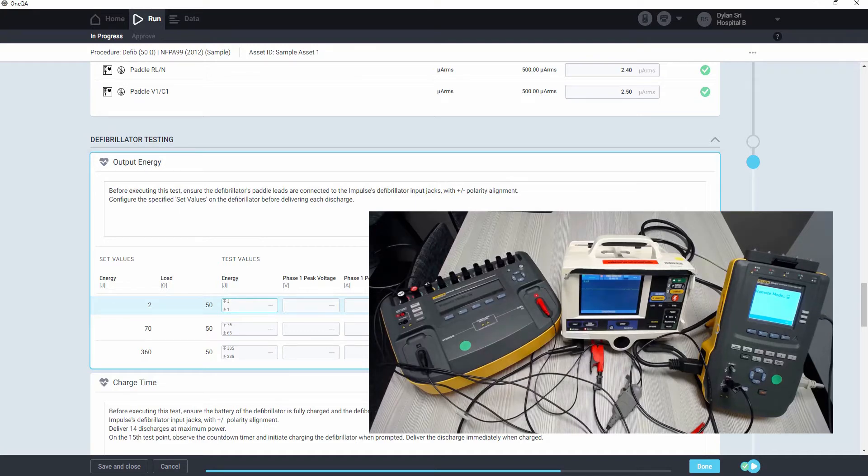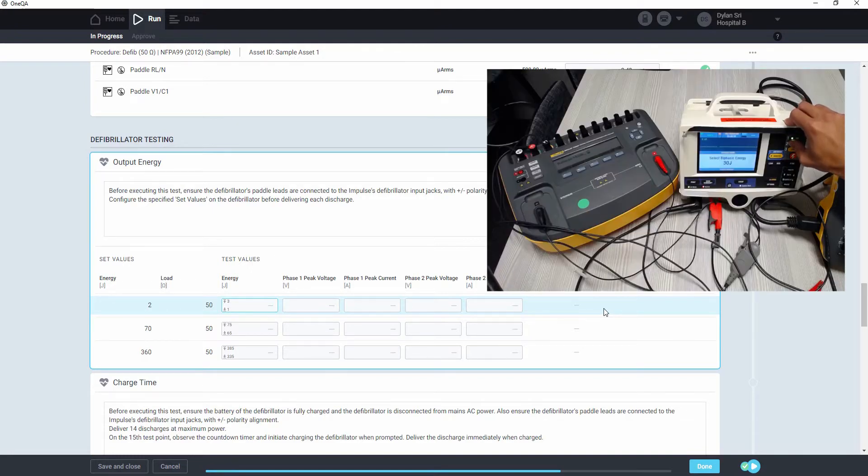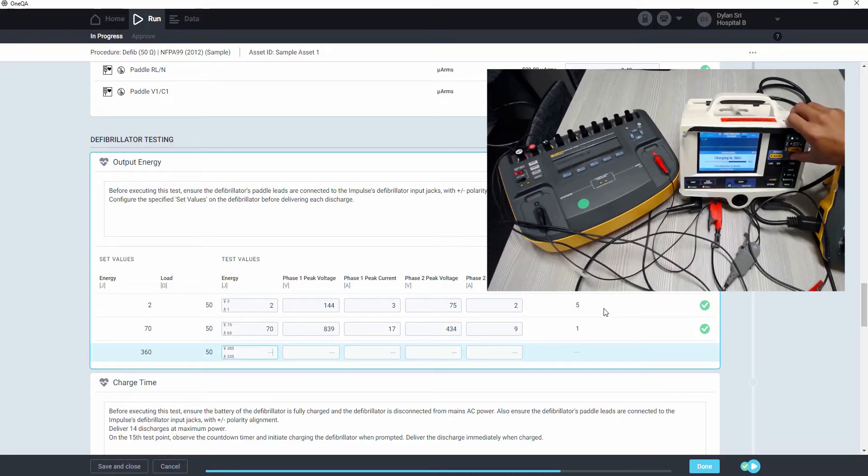Because it's highlighted in blue, we know that this test is currently active and it's waiting for a discharge from the defib. We can look at the set values for this test point and configure that on the defib before delivering the pulse. We'll deliver the pulse and we'll get the data in one QA. It'll move on to the next test point with a different energy selection, and then the final one. So that's the output energy test.